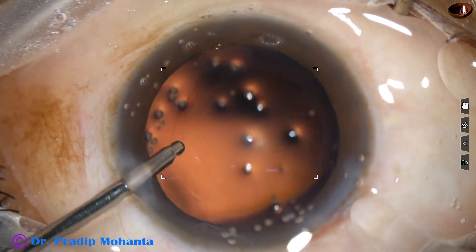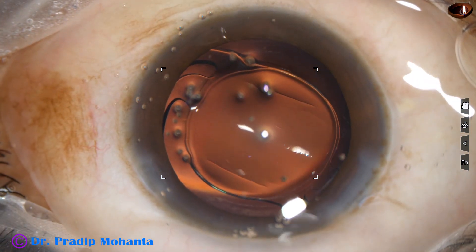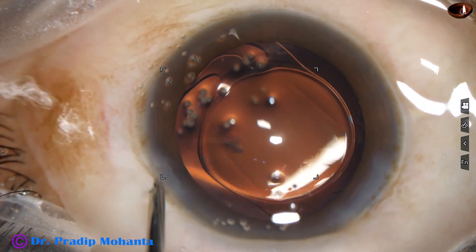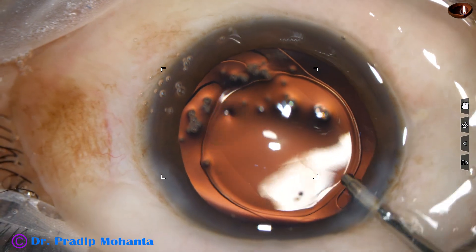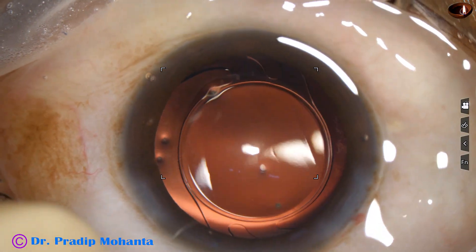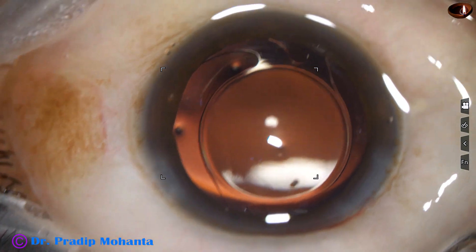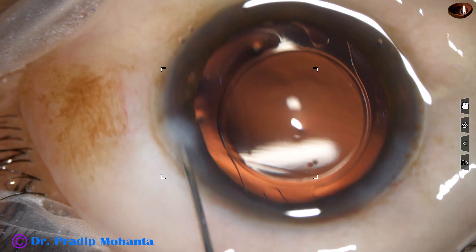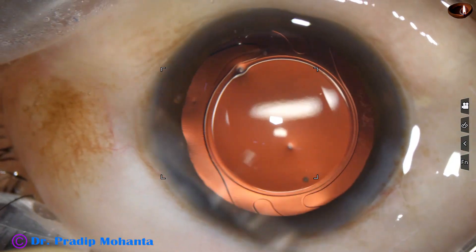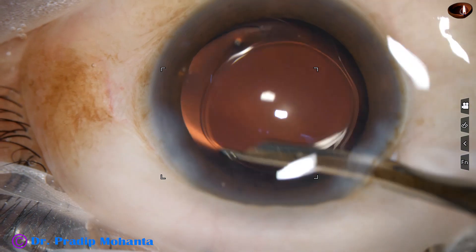A hydrophilic acrylic single-piece monofocal intraocular lens has been implanted in the capsular bag. There is a bit of epinucleus — yes, it has come out through the main wound. Now we are towards the end of the surgery. This is a bit of moxifloxacin. The side port is closed by hydrating the corneal stroma, and then a final lavage of the anterior chamber is done with BSS. This is very important — the final lavage.